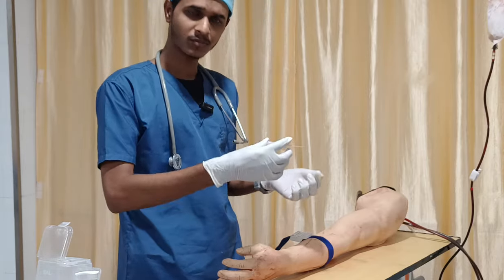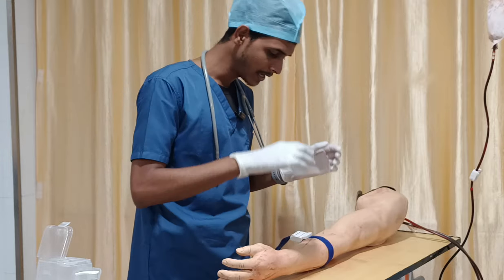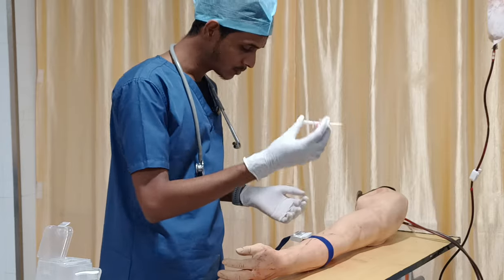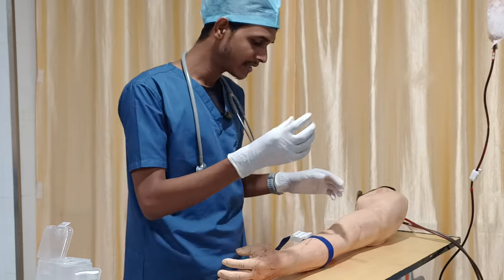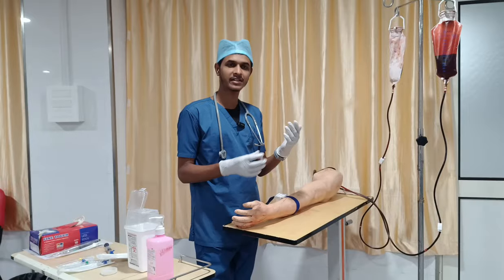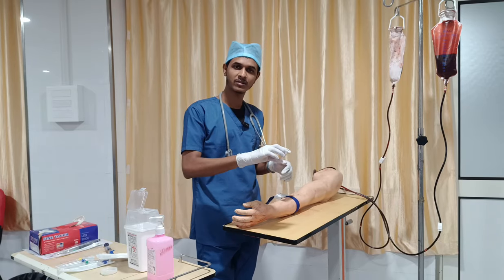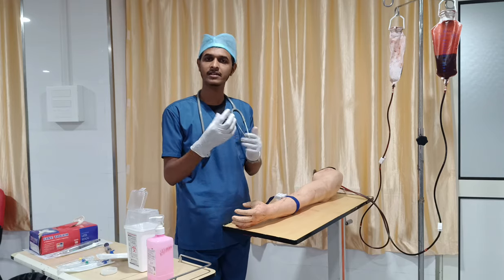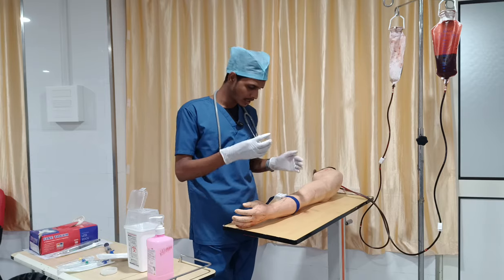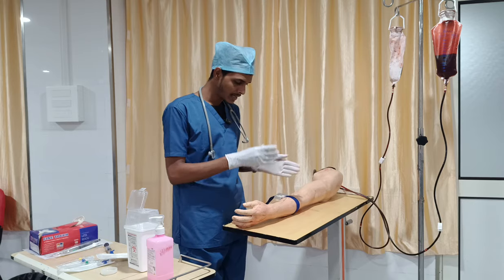Now we are getting into the procedure. After the sterilization area has dried, you verify again, and then go with the insertion. While inserting, what angle do we have to maintain? If you refer to a book, they mainly give a 10 to 30 degree angle. For theoretical purposes that is completely okay, but practically it will differ. Sometimes you have to go somewhat deeper and then reduce your angle, so it might be a 45 degree or 40 degree angle. For theory you can remember 10 to 30 degrees or 30 to 45 degrees, but clinically it will vary.